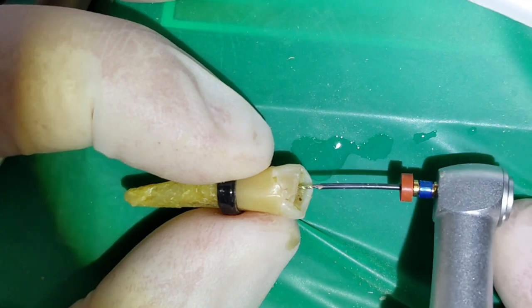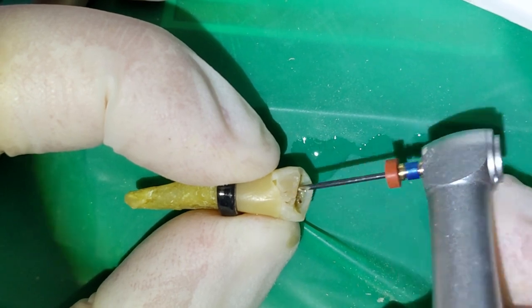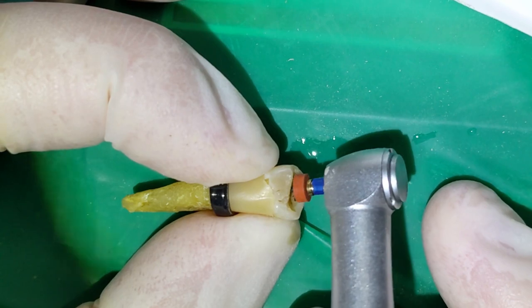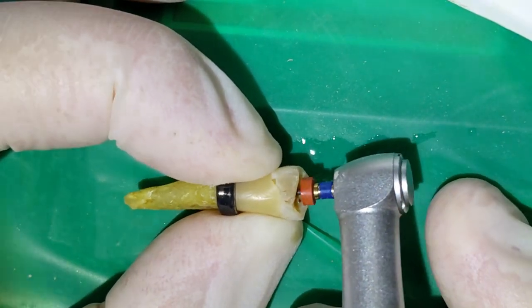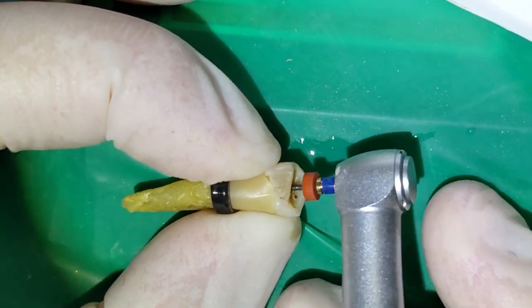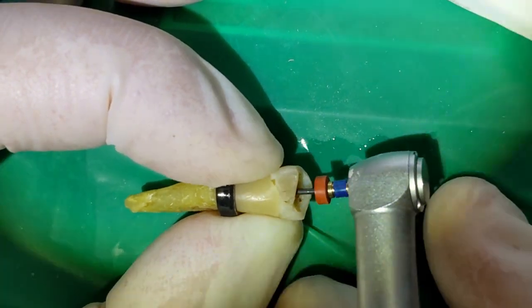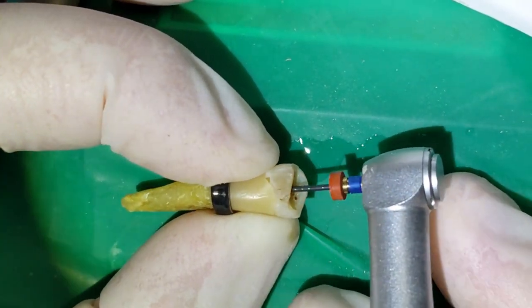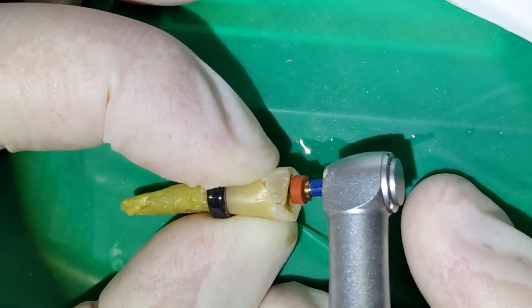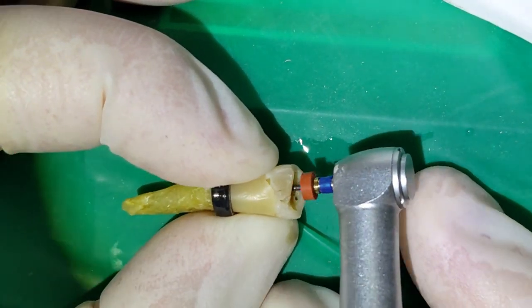Straight tooth like this, because it is straight, there's no sharp hooks or curves, you can actually get away with doing a much bigger file because there's no sharp bends. If the tooth had a pretty sharp bend, I would go smaller. I'd even stop at a 25. Depends. The really, really sharp bends, I refer those out to the root canal specialist, the endodontist. That's what they're trained to do. They do those every day. I don't do them very often. I don't do those really sharp hooks. If I can avoid it, it just makes it more complicated.